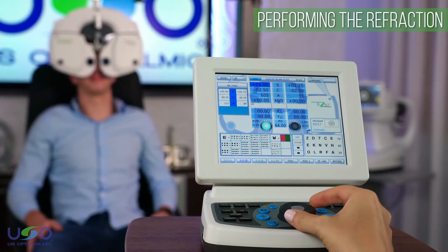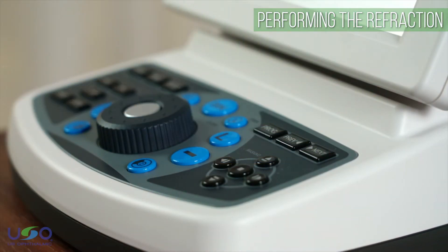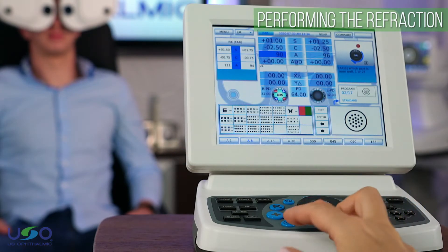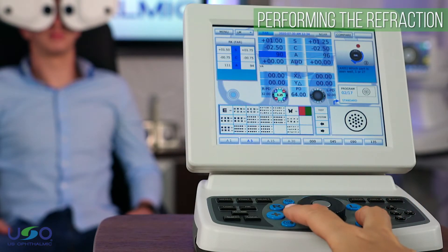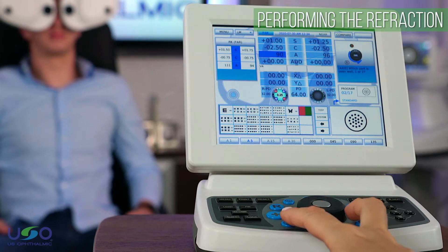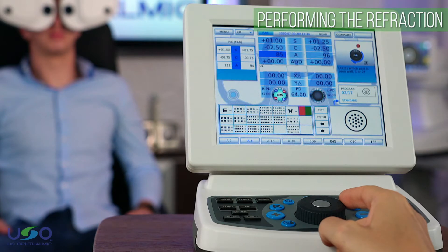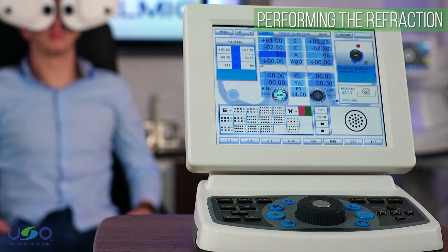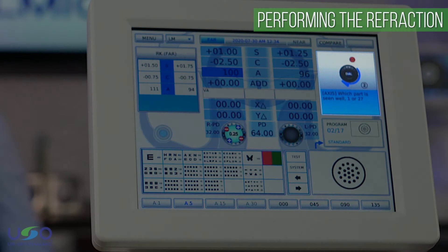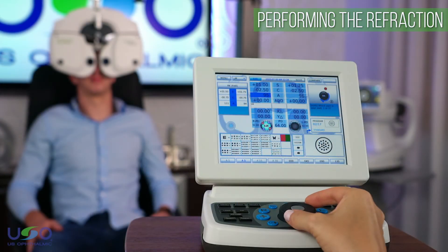Once the adjustment of the spherical power is completed, you begin with the adjustments of the astigmatic axis by selecting the cross cylinder. By pressing option 1 and option 2 on the keyboard, you can alternate between both cylinders. According to the feedback provided by the patient, you can adjust the astigmatic axis until balance is achieved. The guide window suggests to the doctor in which direction to adjust the knob according to the patient's response.